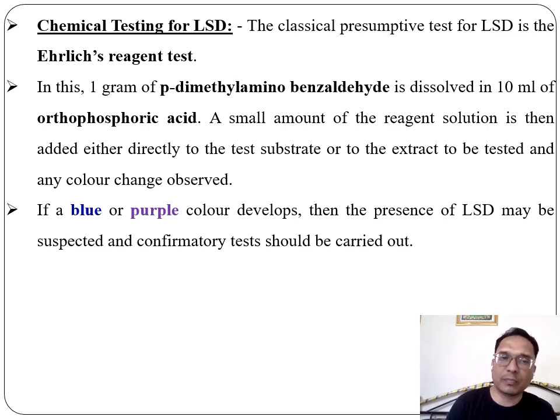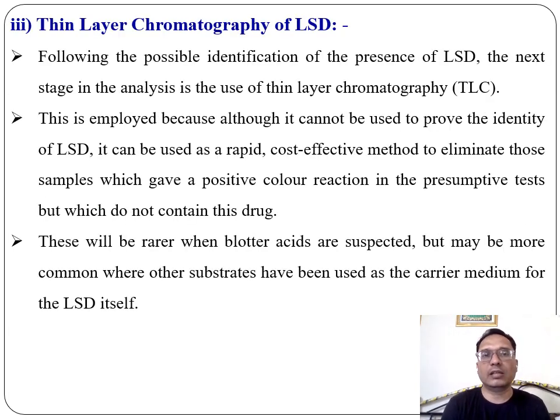If a blue or purple color develops, then the presence of LSD may be suspected and a confirmatory test should be carried out.